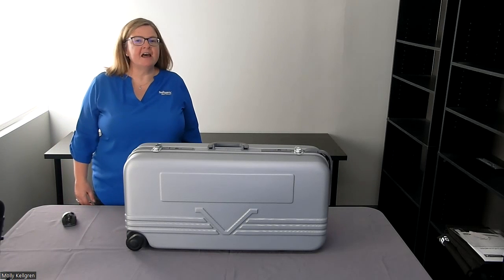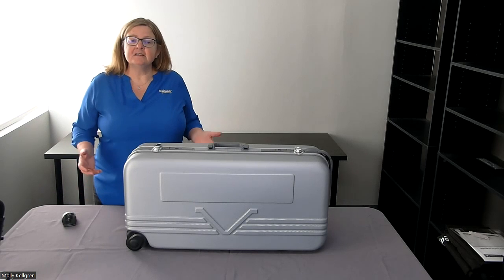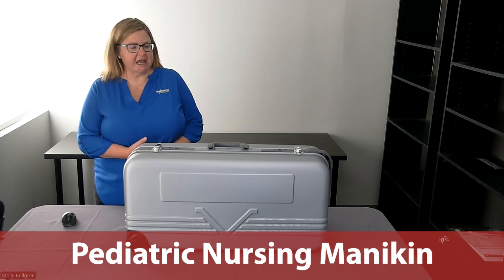Hello, my name is Molly Kellgren, Health Science Education Product Manager here at RealityWorks. Thanks for joining me today for a demonstration of our pediatric nursing mannequin.